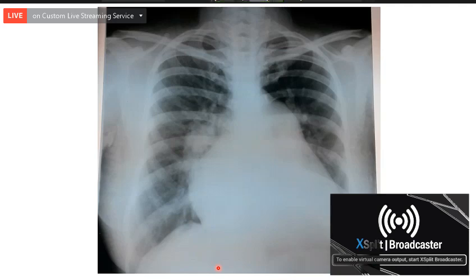Properly positioned. Yes. There's cardiomegaly, cardiothoracic ratio of around 65 to 70%. Yes, on visual assessment you don't have to say 65 to 70%. You can say on visual assessment there is cardiac enlargement. If you want, you can use the words mild, moderate, severe. What do you think of the cardiac enlargement? Is it mild, moderate, or severe enlargement? Moderate. So mild to moderate at the most. Maybe the cardiothoracic ratio may be around 60%.